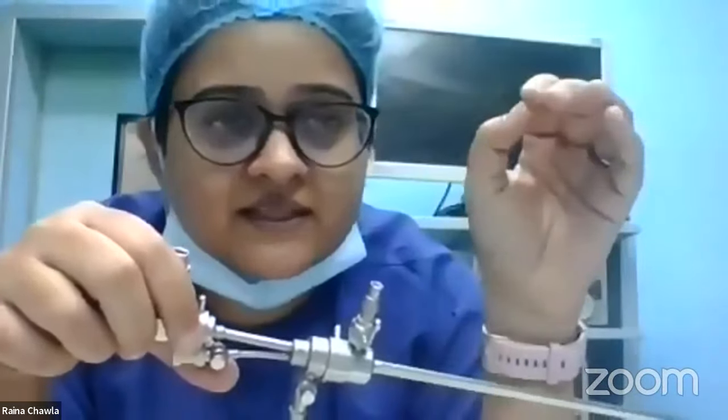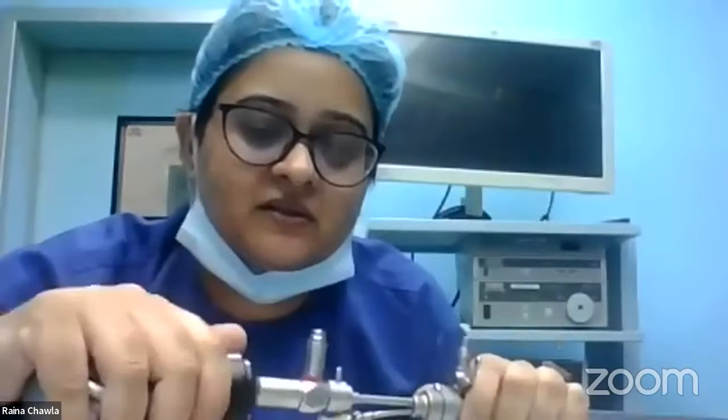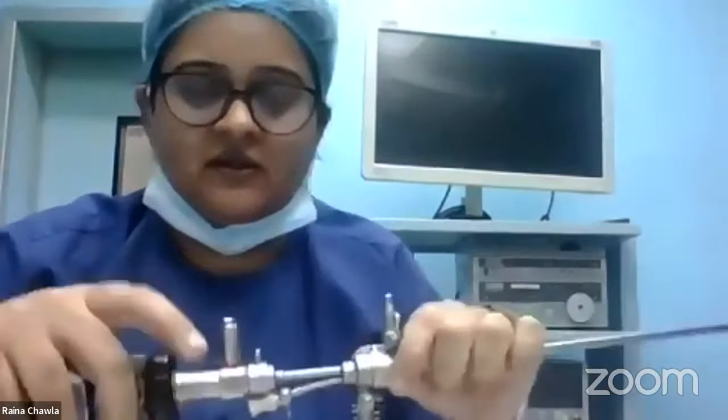Normal saline, glycine or mannitol are the commonly used distending media because the uterus is collapsed. You have to open it up to visualize the uterus. Like the abdominal cavity, we use liquids to distend the uterine cavity. So we introduce this, and then through these channels we attach tubing, and this fluid will go inside and open up the uterine cavity. And again we attach the camera system here. This is our hysteroscope. The light source will come here.